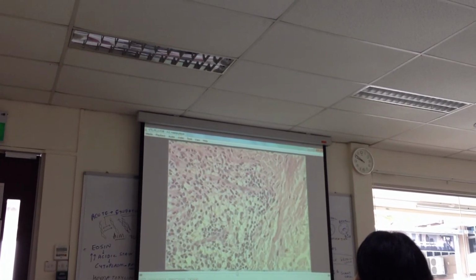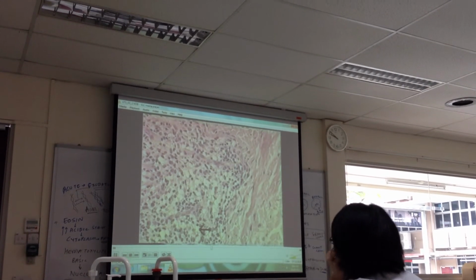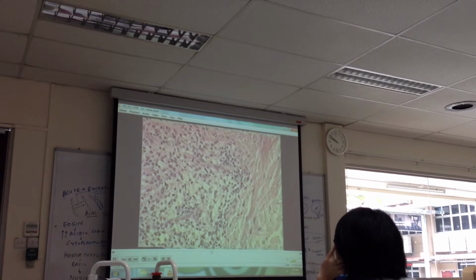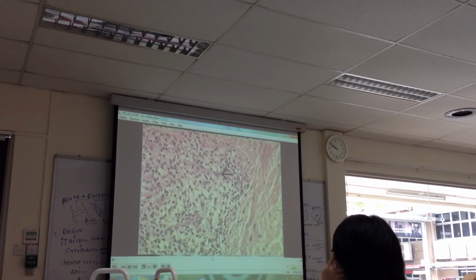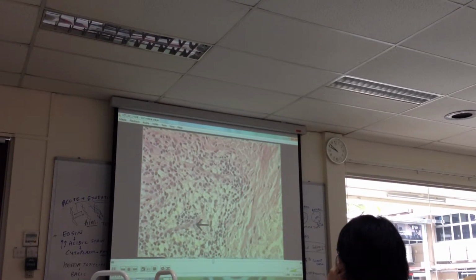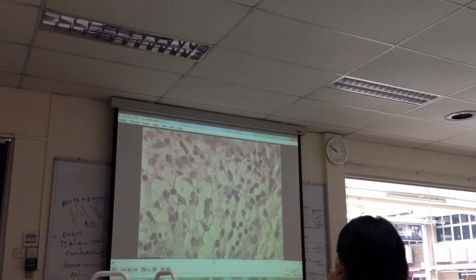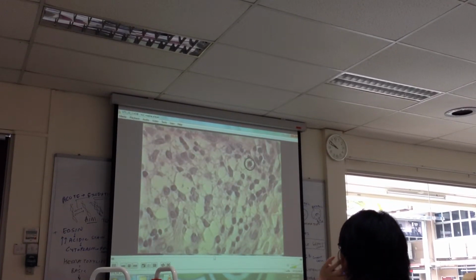In the dermis, a chronic inflammatory infiltrate is prominent in dermatitis. It is often around blood vessels, such as here and here. The infiltrate includes lymphocytes, usually T cells.